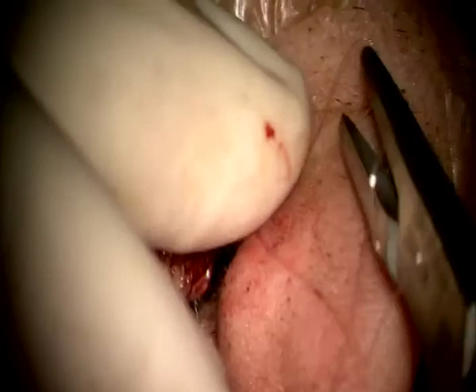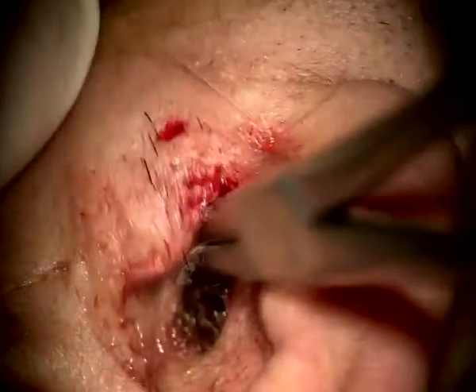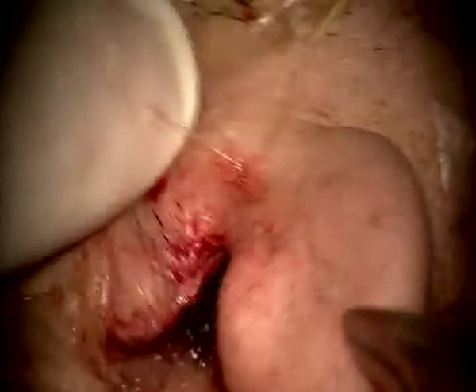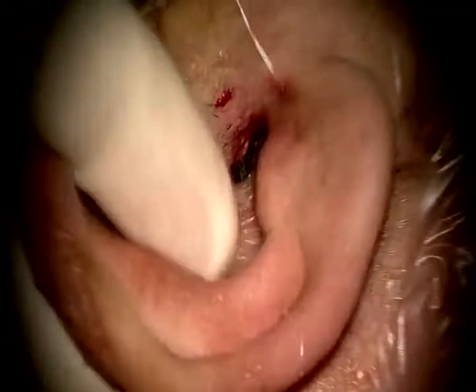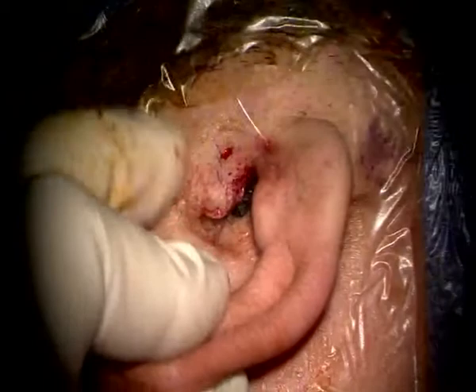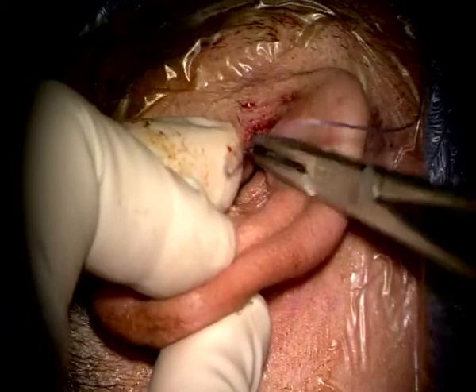Yeah. Cut both, please. So I always talk about aligning the cartilaginous with the bony. So, of course, we do that in the clinic all the time by pulling the ear back and up. So what I want to do is place what I jokingly call the little Vichy stitch. And basically what I want to do again is I want to have something to pull the ear back and up like this. So you see that, this is what I want to do. So I put it just beyond that anterior cartilaginous kink. And you gotta do it in steps. It doesn't work if you're doing it in one.